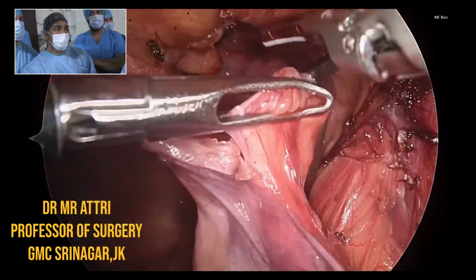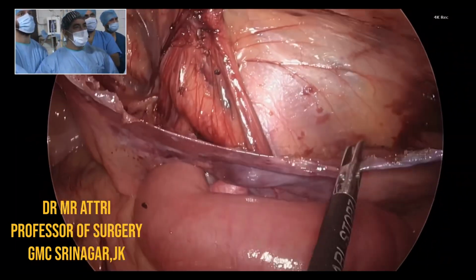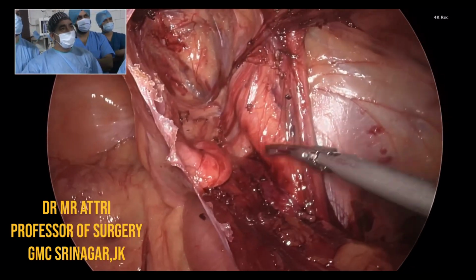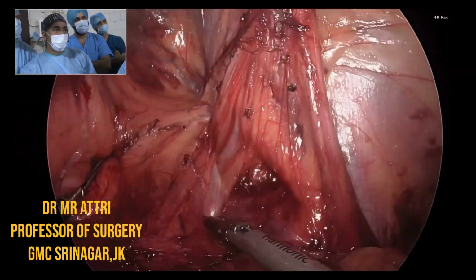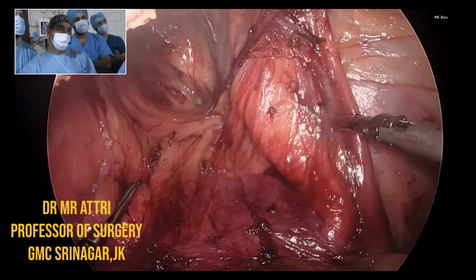Professor Atri, are you getting me? Oh yes, I am getting you. So till now we have just dissected out this peritoneal flap, and we encountered a few adhesions here, and we have made this peritoneal limb a horizontal limb. Now this is the lateral spermatic vessels.